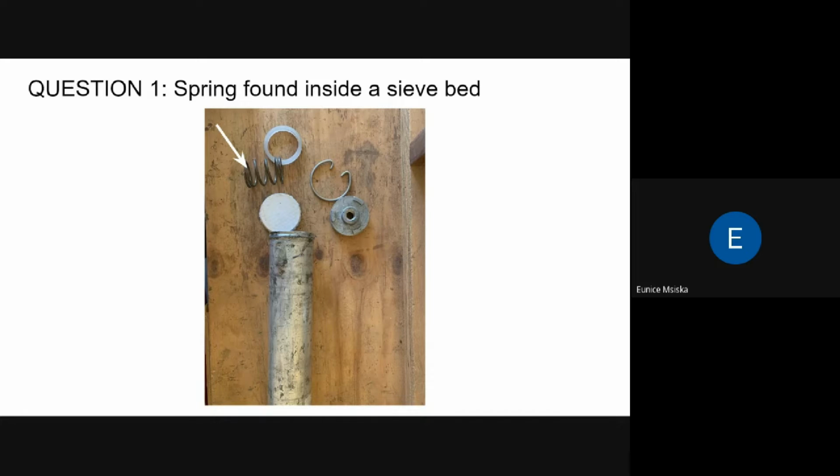It would be challenging to perfectly compress the zeolite without the spring. So the spring provides a simpler solution to the problem. Thank you very much. Thank you very much, Eunice, for that response.